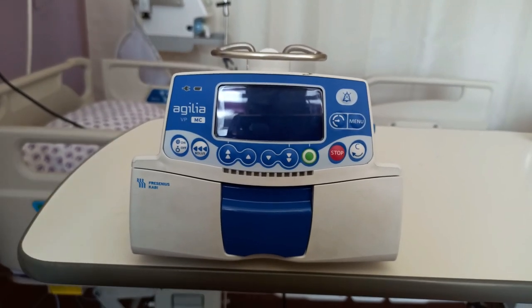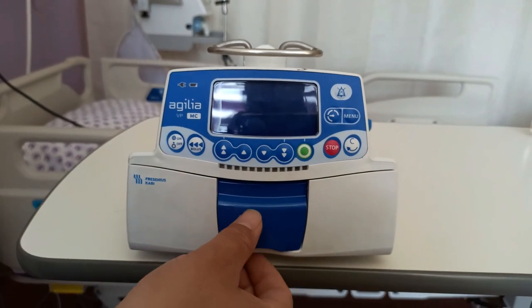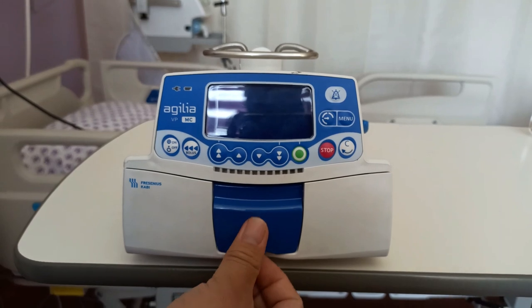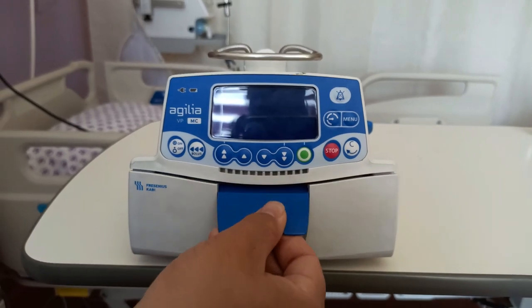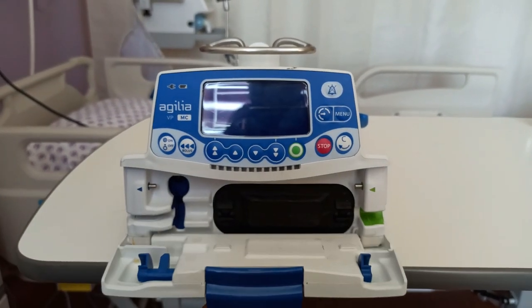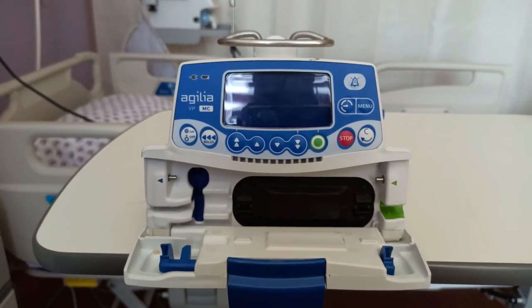The other part of the infusion pump is the door, which can be opened and closed by pulling and pushing a lever. To open the door, you pull in the lever and pull the door; to close, you push the door and then push the lever.